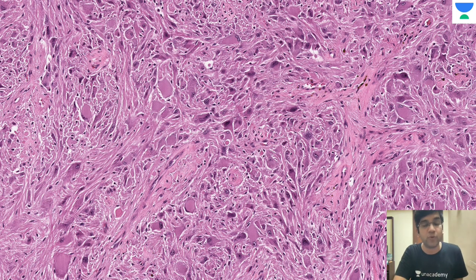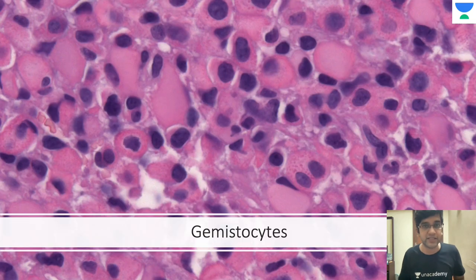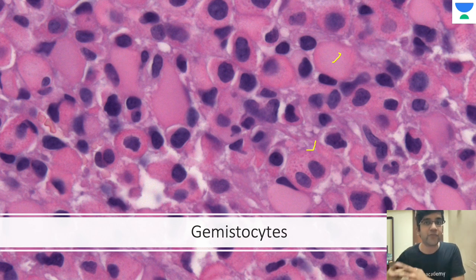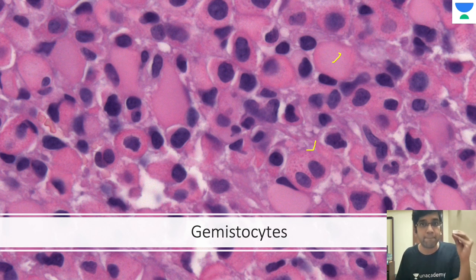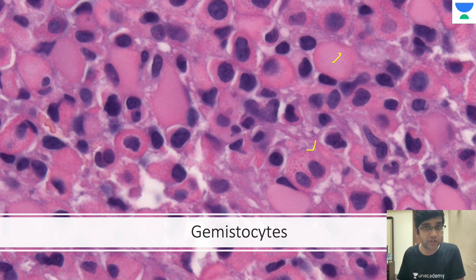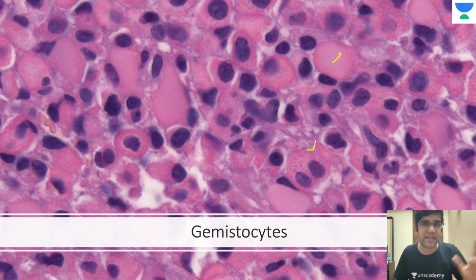With a typical ventricular location, sweeping fascicles, and elongated cells, I'm going to think of subependymal giant cell astrocytoma. In contrast, gemistocytic astrocytoma will have mostly oval and round cells — no fascicular arrangement and more of a pink color without that sweeping pattern. Please make a preliminary diagnosis at low power — scanner view or 10x. Patterns can only be seen at low power. At 20x you should finish the diagnosis. Don't go to 40x, because everything looks malignant and bizarre at 40x.